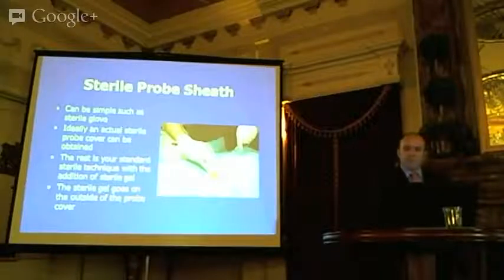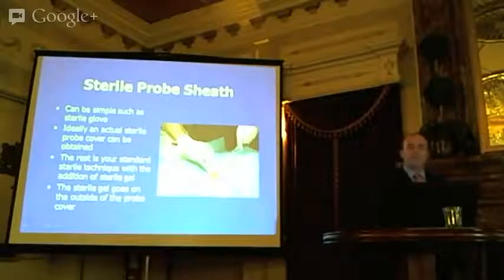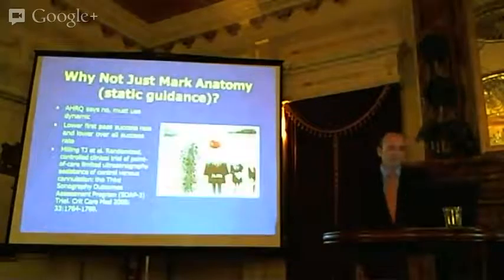Obviously, sterile gel. What was interesting about this transducer is I used it for, I want to say, a photo shoot for this photograph, and then I threw it away. This is a huge guy, big neck, and I actually did not get this 2.5-inch needle down into the IJ because this needle guide ate up so much length. So after this picture, I pulled all that off and threw away this needle guide, which was $500. I found out then. I had no idea. I never used it again, obviously. Modern ones are better than that.